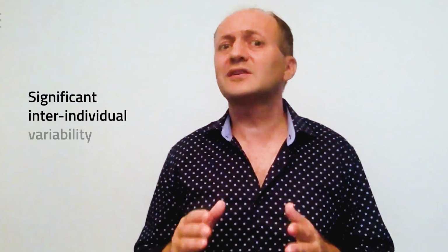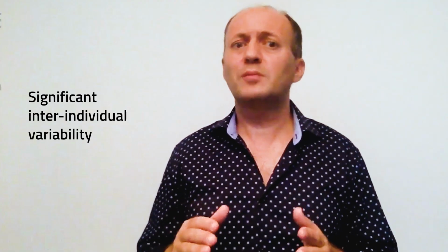In the case of sensitivity, a fairly large difference was shown by different subjects and an inter-individual reproducibility problem arose. A problem largely known in medical research. Each individual reacts differently to the same treatment, and also impedance spectroscopy keeps this trend. How could it be possible to manage this high intrinsic uncertainty exhibited by the measurements?